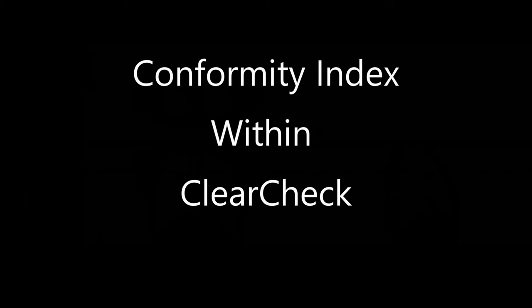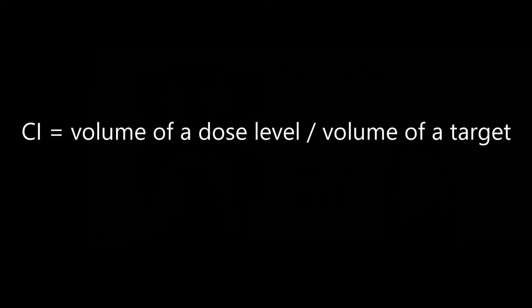First, it's important to understand Conformity Index within the ClearCheck software. ClearCheck defines Conformity Index as a ratio between the volume of a dose level and the volume of a target. The equation in ClearCheck is defined as PIV divided by TV.